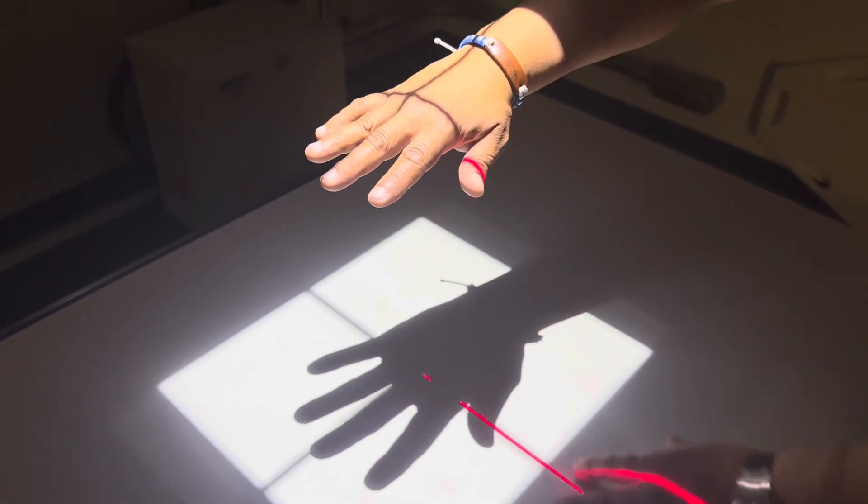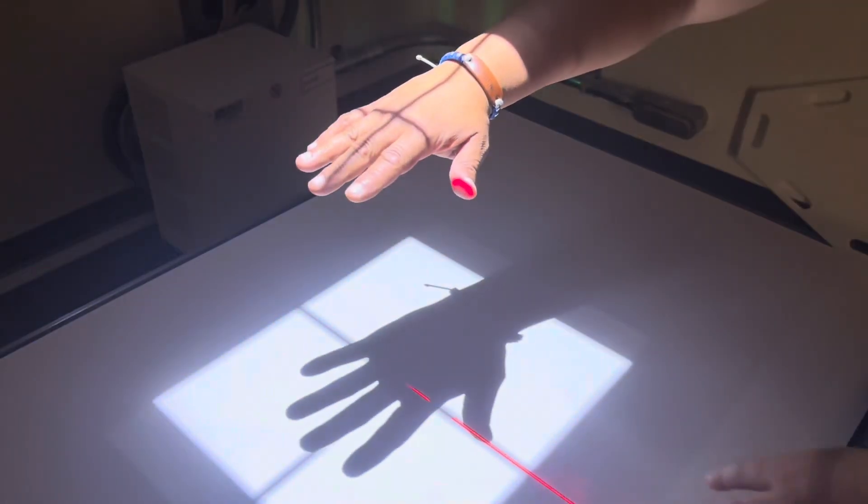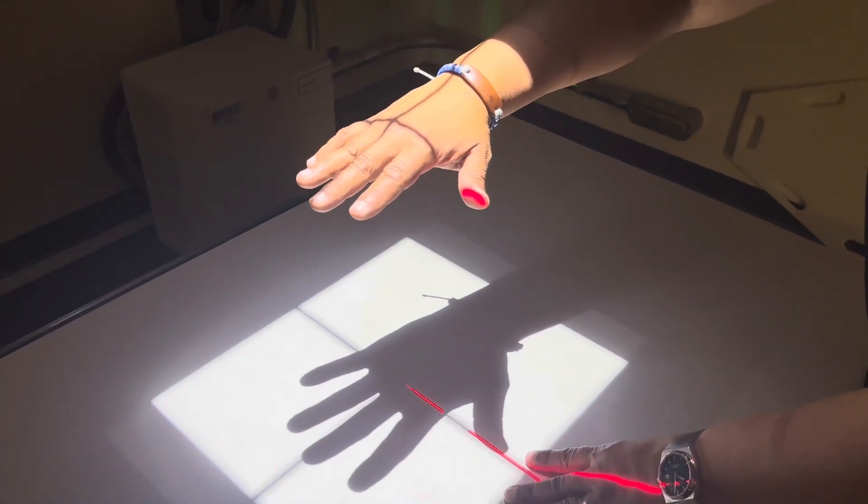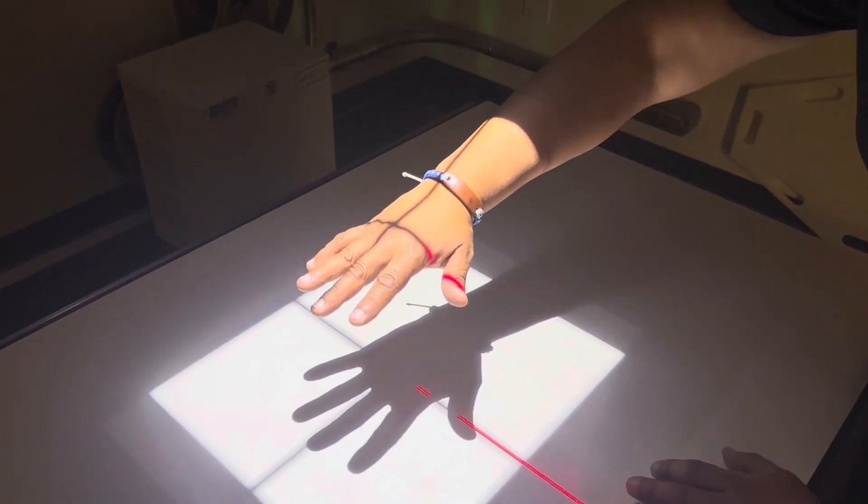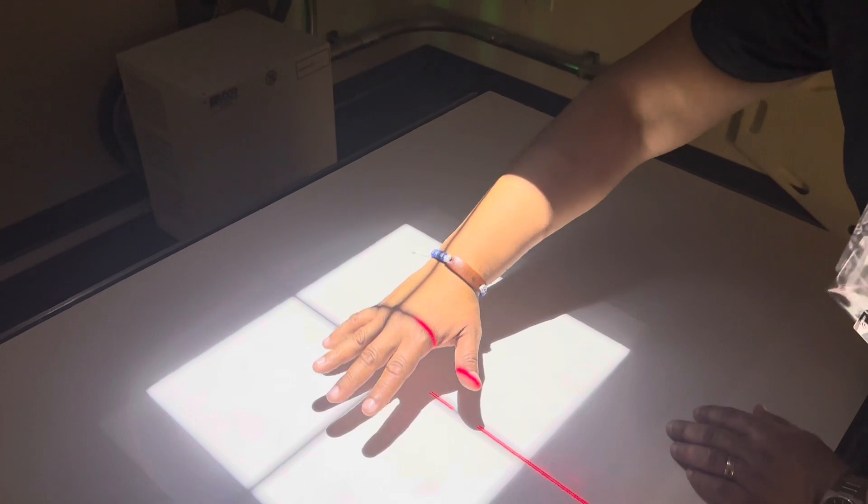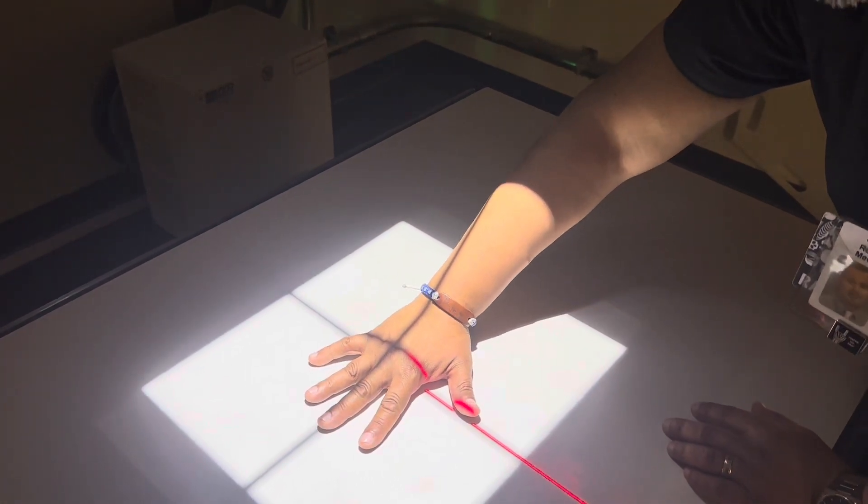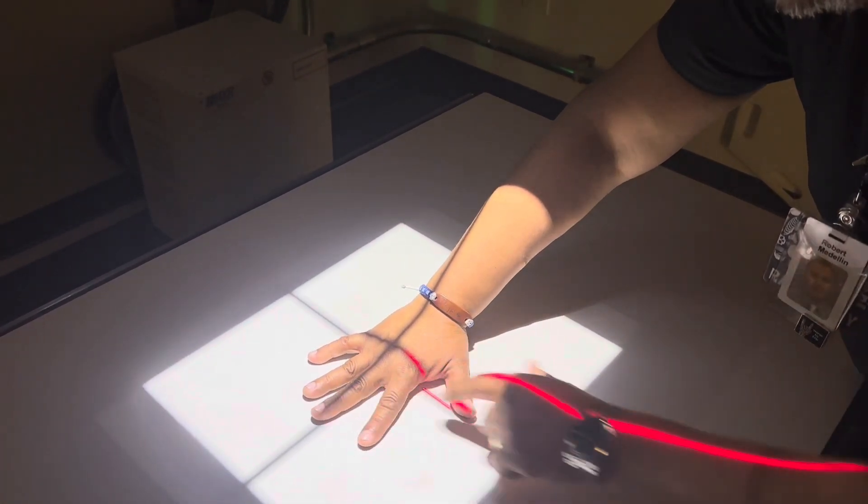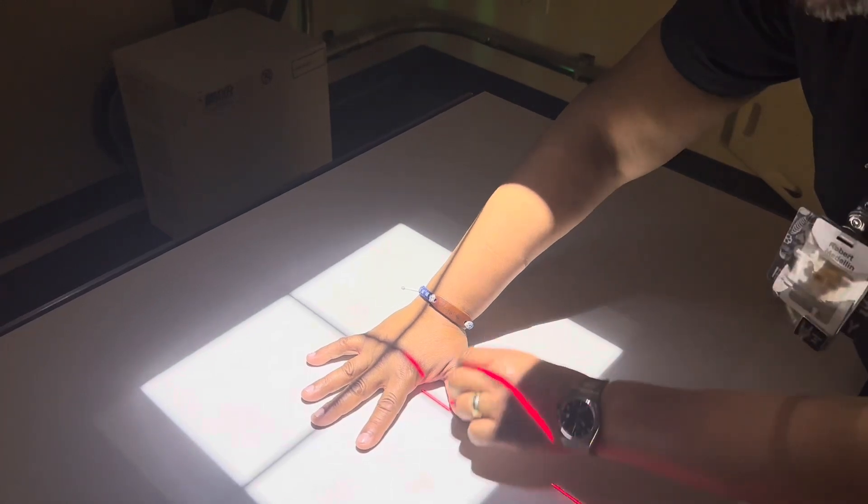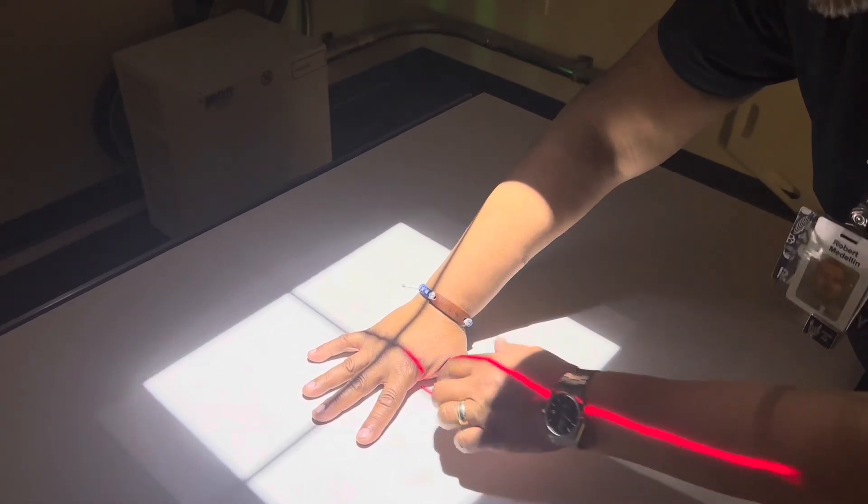The shadow, if I use the flat panel detector it's black so you're not going to see the shadow too well. So I'm going to use just the whiteness of the table. But again, if you decrease the OID, the object to image distance, you see how the shadow is getting smaller? So there's still a shadow, you can't get rid of it completely.